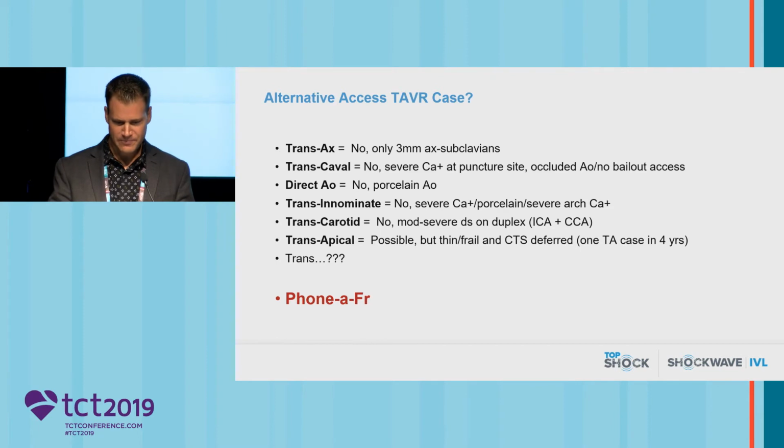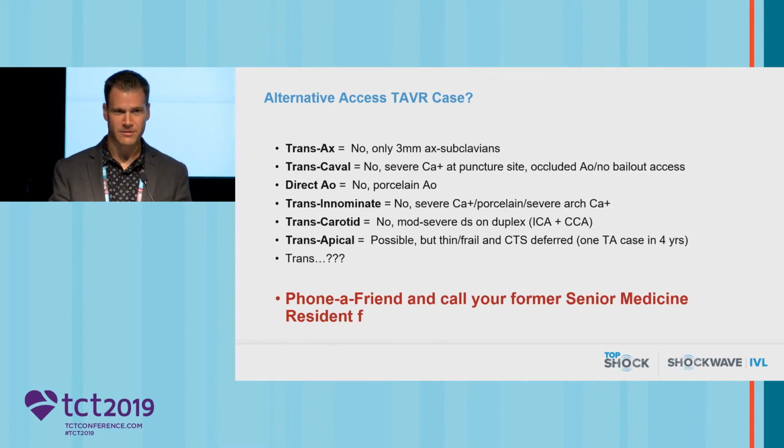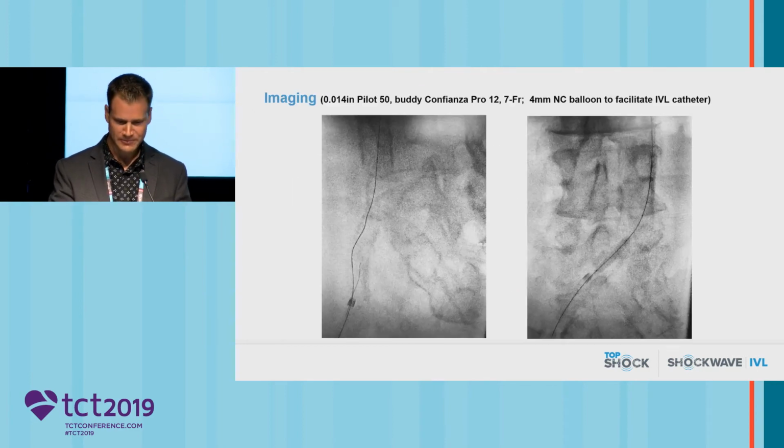So what I actually did was wanted to phone a friend here. My former senior medical resident was Dr. Tayal there at the end of the table. So what do we do? We went back and used our coronary CTO wire skills. Used a Confianza Pro 12, a Pilot 50 coronary wire, and a Corsair 135.